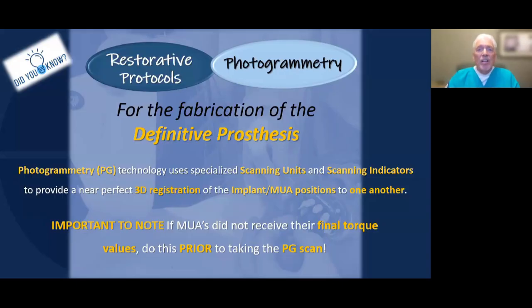So it's very important, if you're the restorative doctor and you didn't do the surgery, to communicate with your specialist ahead of time to make sure whether or not the multi-unit abutments have been torqued to their final insertion torque.